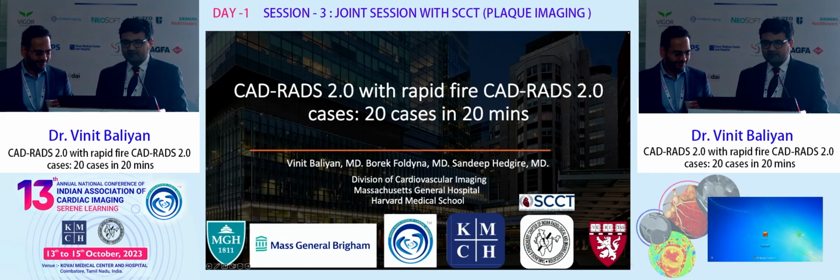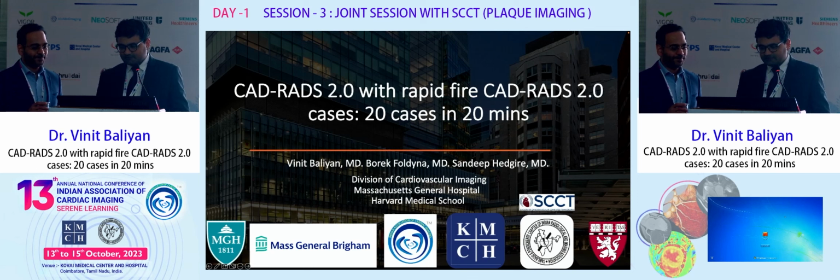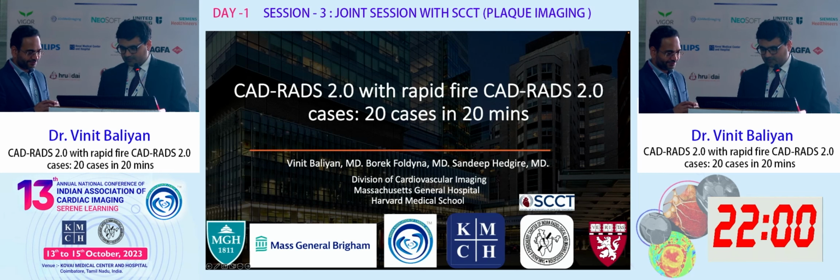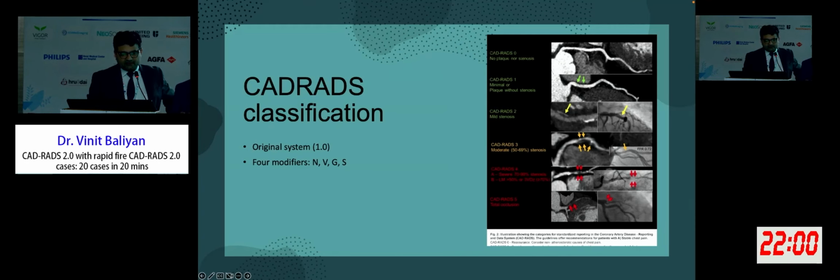Alright, so we are going to quickly summarize CAD RADS 2.0 because some of you are not using it in clinical practice. So we'll do a quick recap of the CAD RADS and then we'll go from there. Borek was also supposed to be doing this with us, but unfortunately couldn't be here. But he contributed cases.